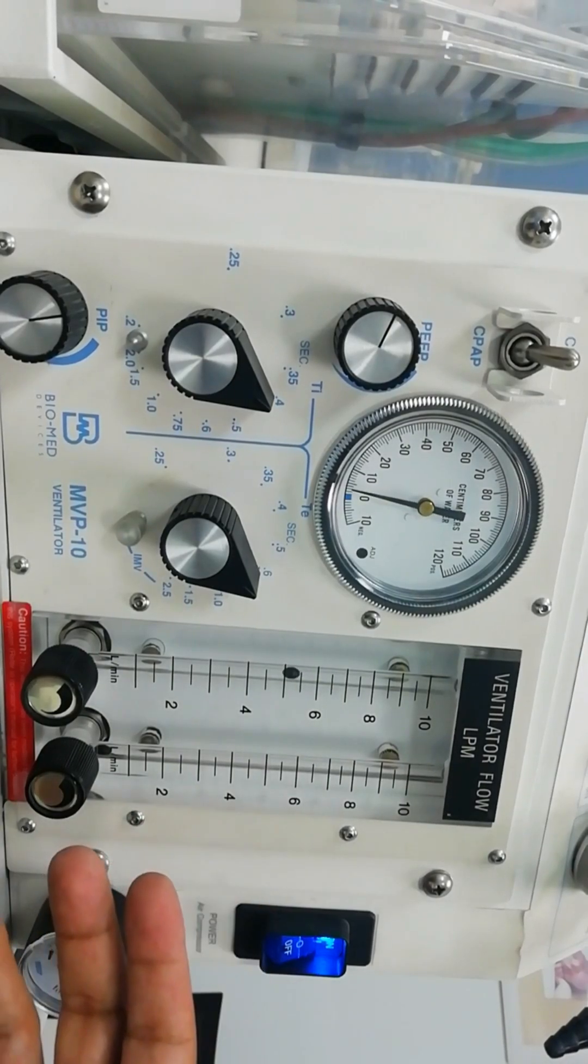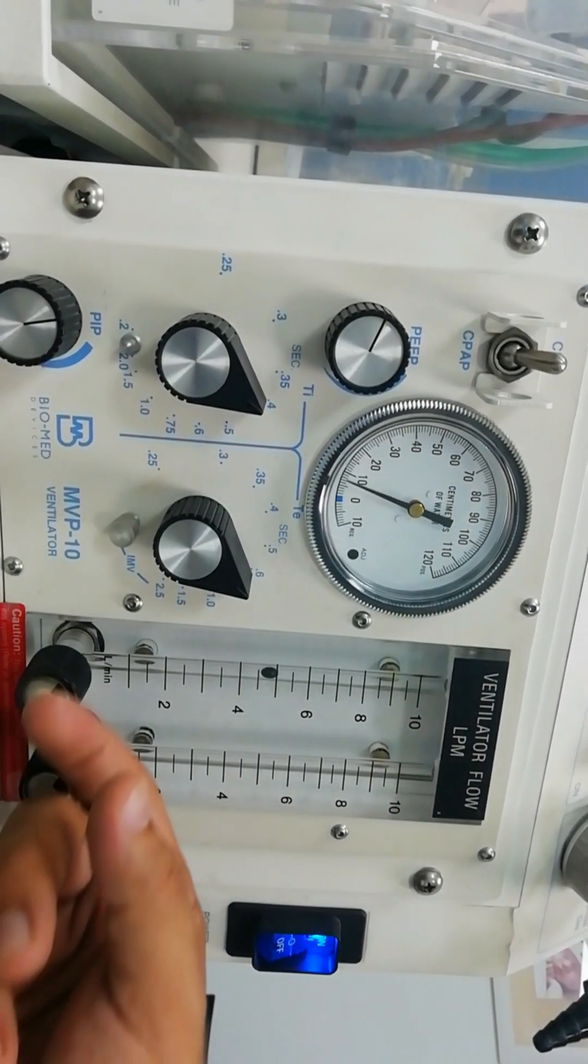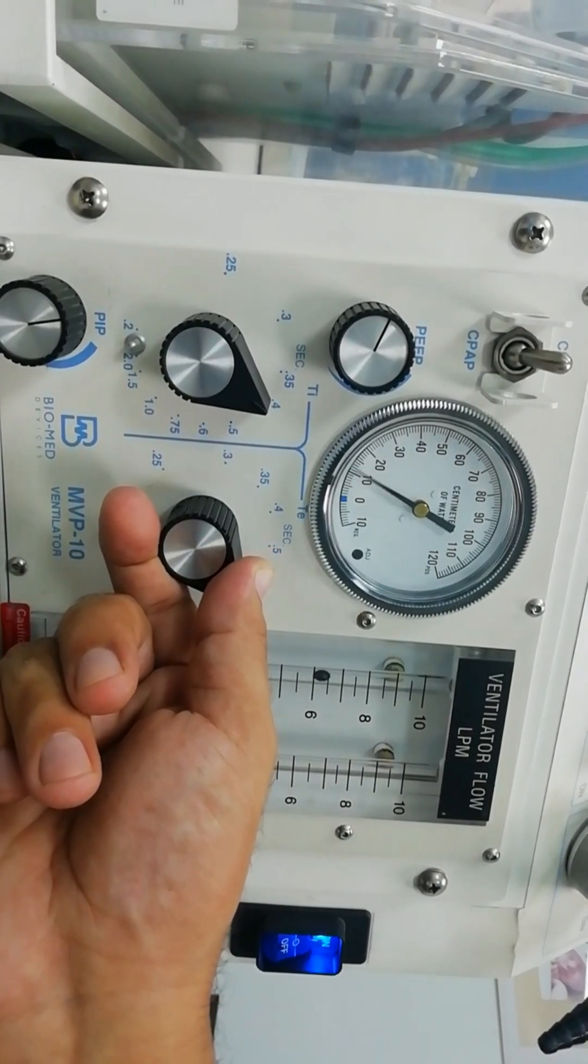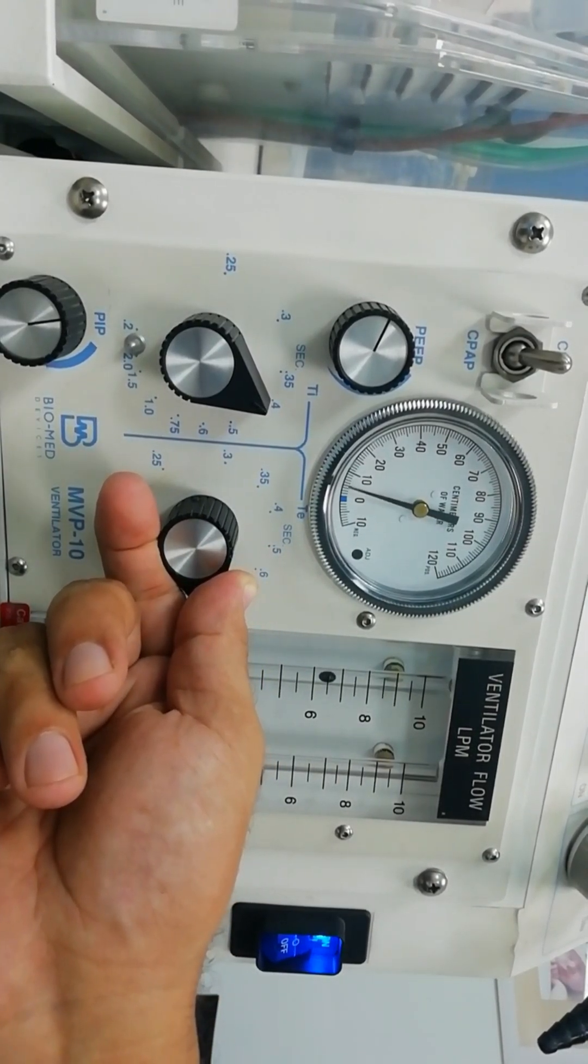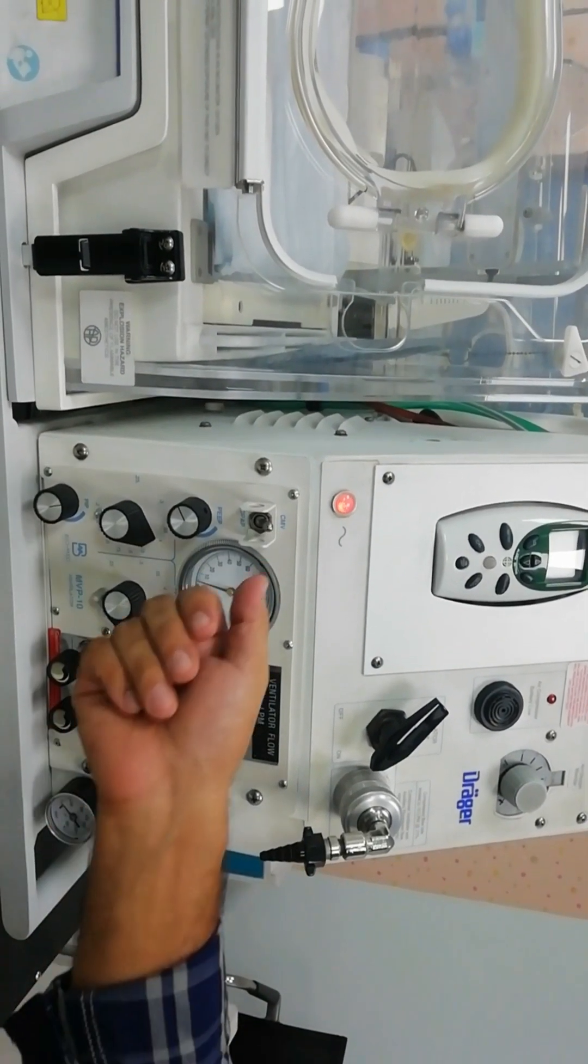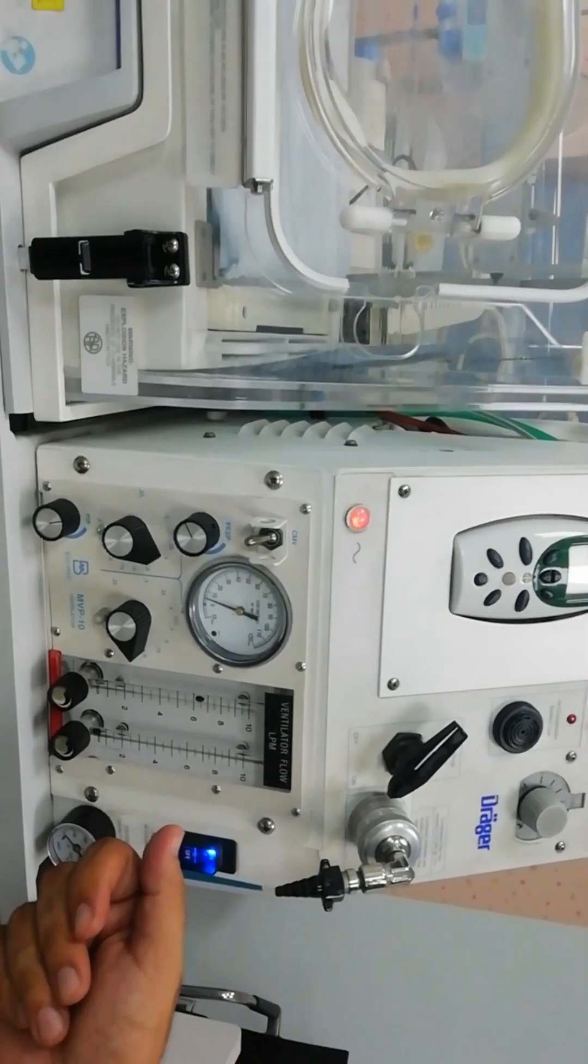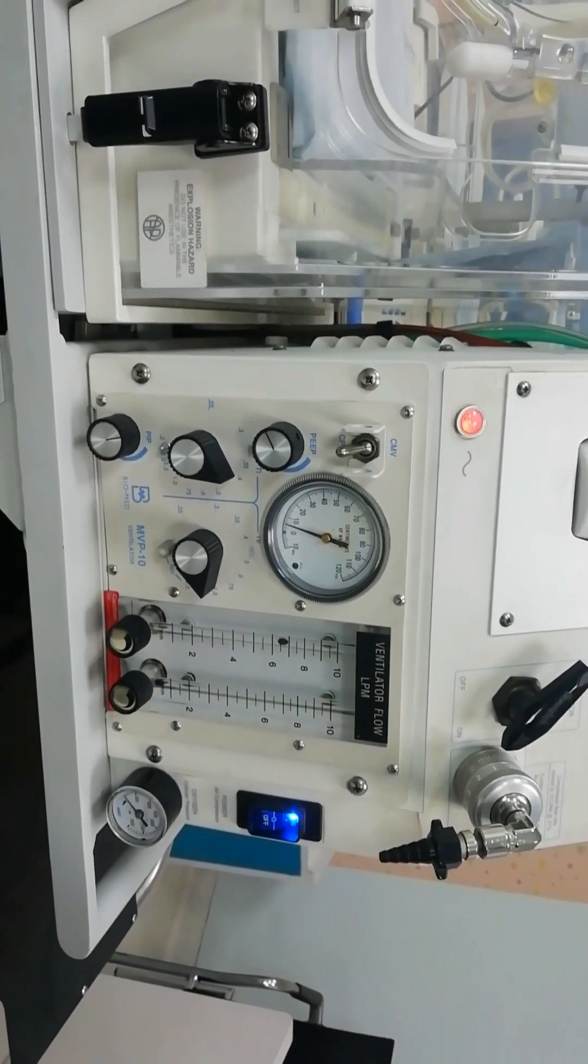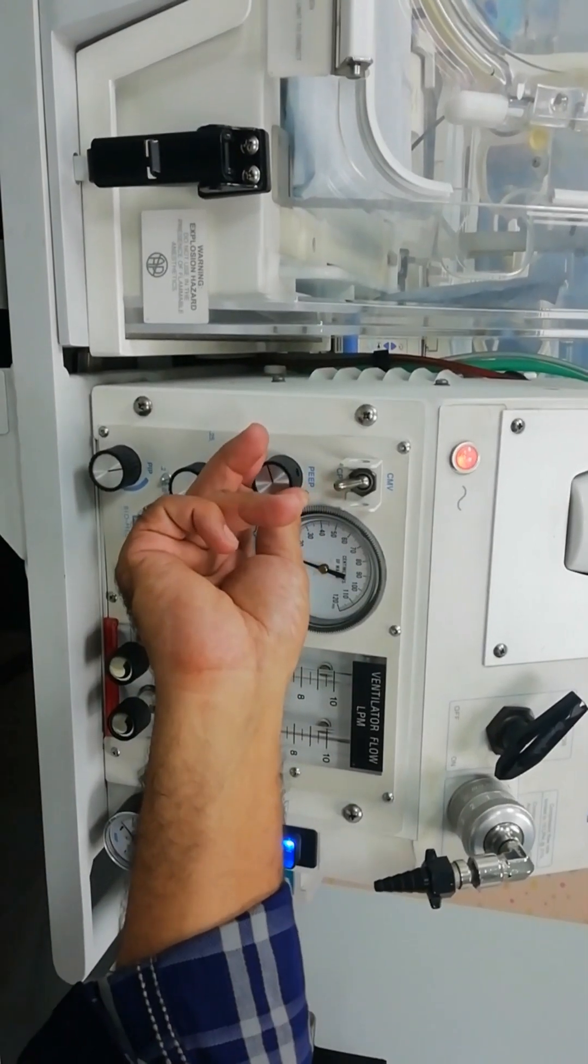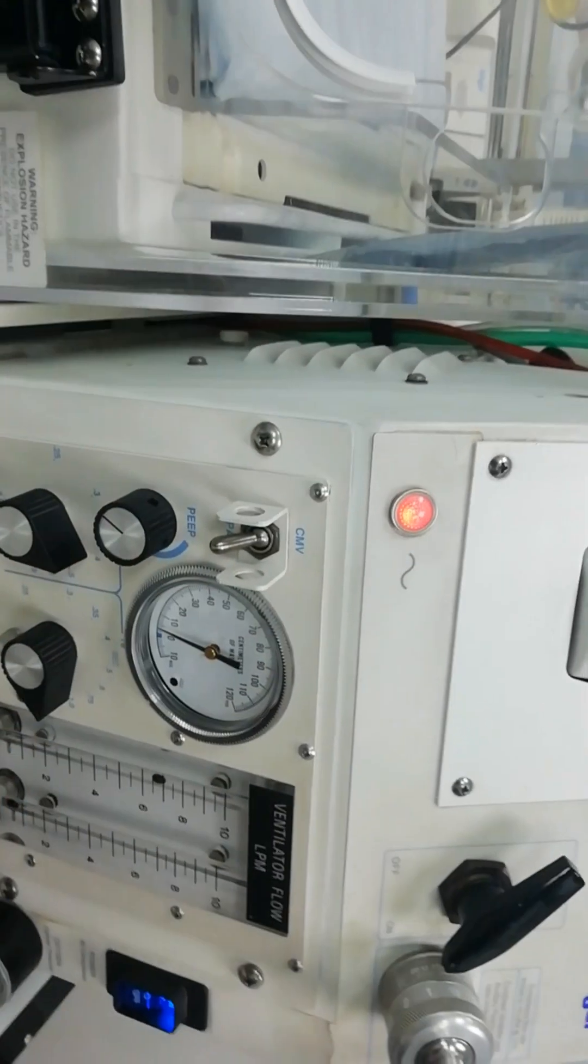To decrease the respiratory rate you can increase the expiratory time to the desired. For the CPAP mode we're going to switch down the button and you can see that there is no peak inspiratory pressure given. Only we have a PEEP so we can increase it or decrease it according to our needs.